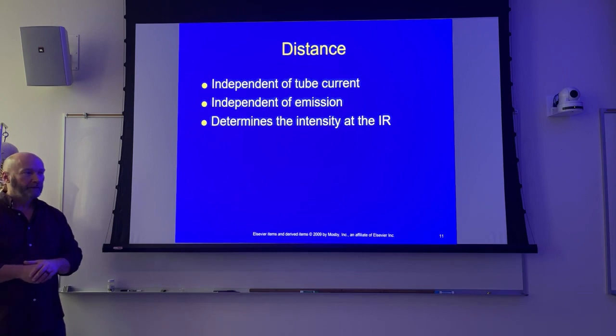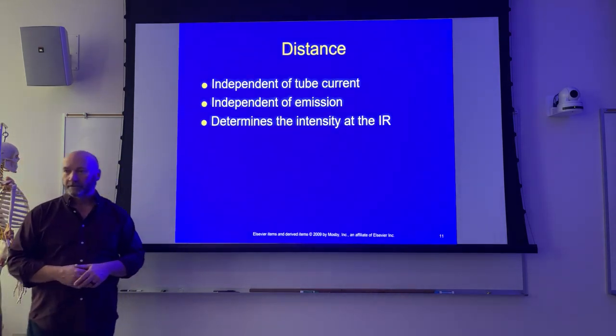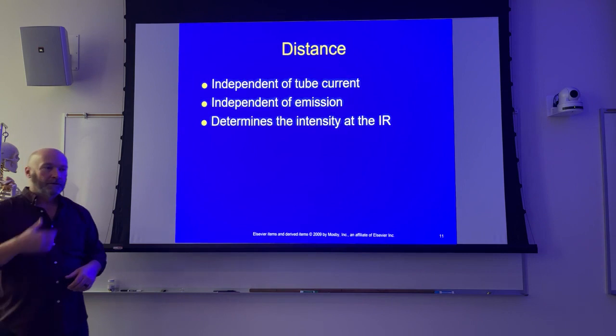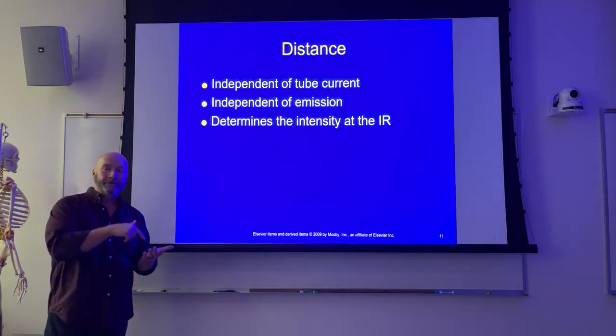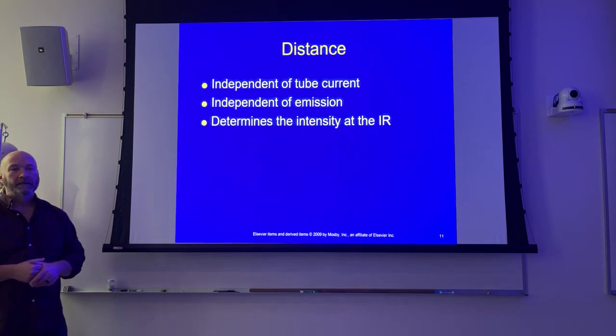You push the button, right? If you're shooting portable, you have to push a lot of buttons, but if you're in the department, you push the button that says AC joints, right? And you shoot at 40 inches. What happens when you mash that button? What all does it set? Do you know?